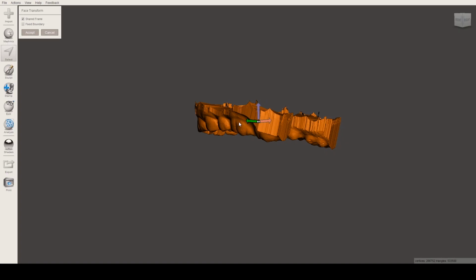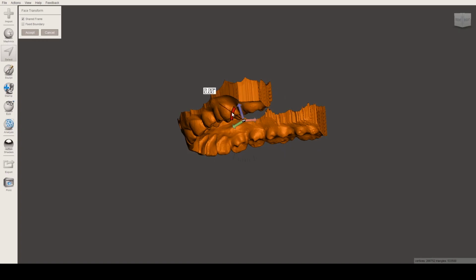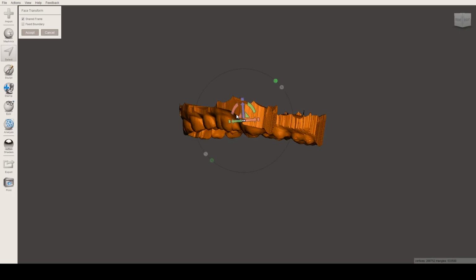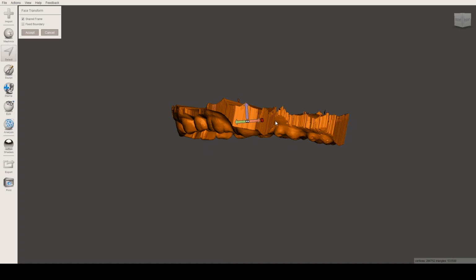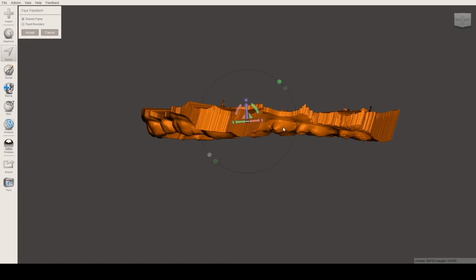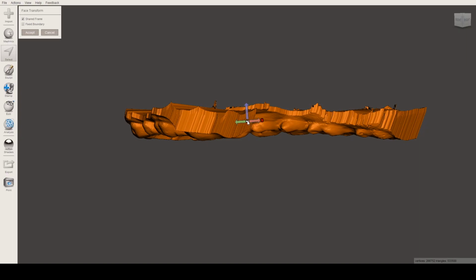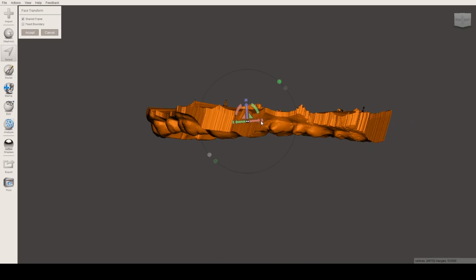Okay, the red and the green moves it to the left or the right. So let's actually move it around a little more. Oops, that's too much. See, this is what happens when you have a slow computer the same as me. How can we rotate this? There, it's rotating. No, it's not rotating, it's expanding. So this red button right here is not rotating it, but expanding the model. We don't want that to happen, so let's just put it back to the original size.